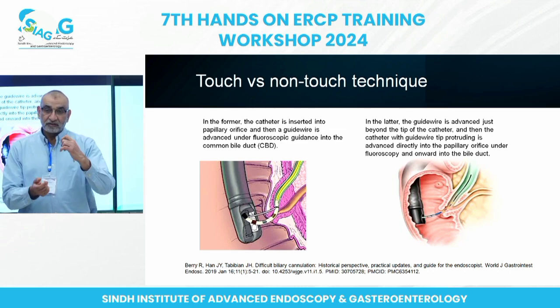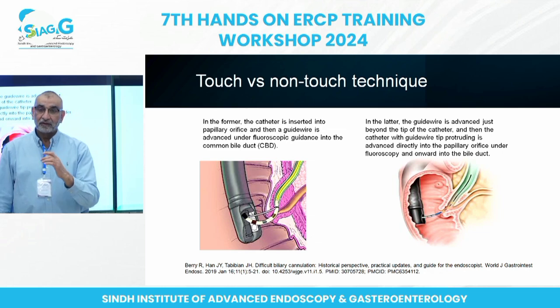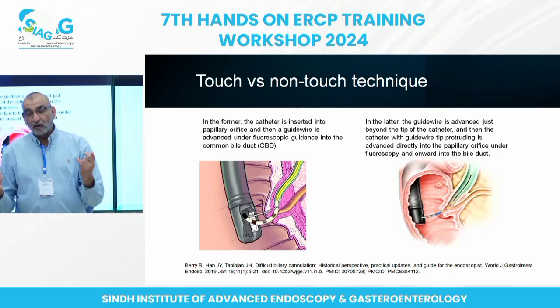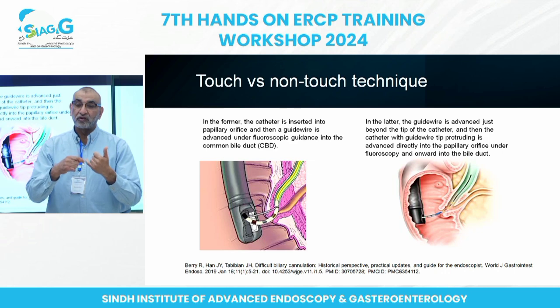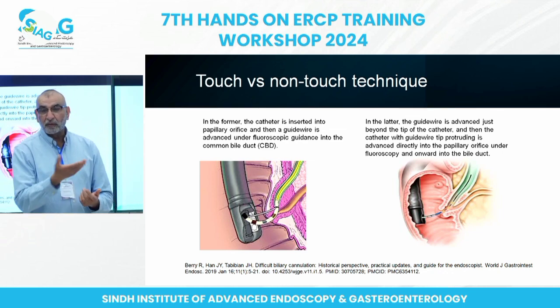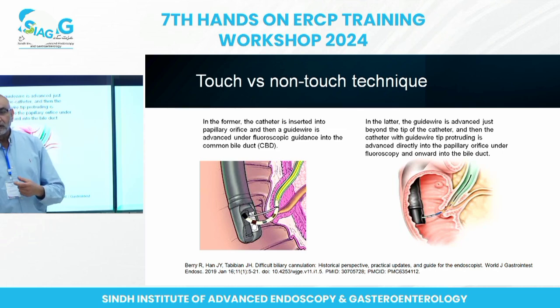So you adjust it from your wheel and you do it from there. Right. Because the sphincterotome is being operated by your assistant. And normally, nowadays we use the short guide wire, so we can control it ourselves because we use a locking system. Even with the short guide wire, I still use the old system of getting my assistant to do it for me. Some of the younger endoscopists use it themselves. I only use it in special cases. Otherwise, I ask my assistant to do it for me. Usually, they are very good.